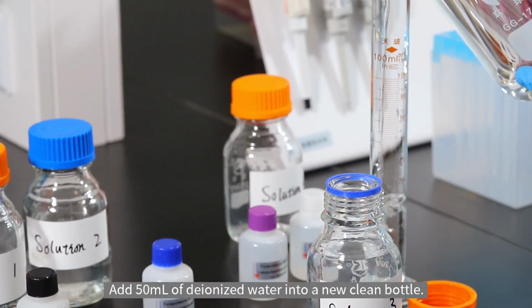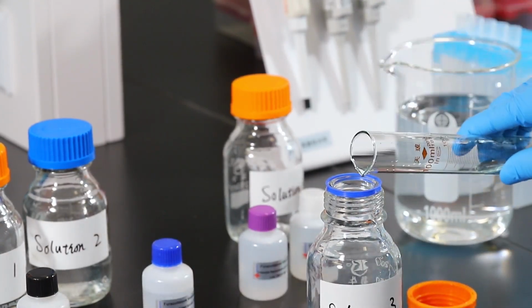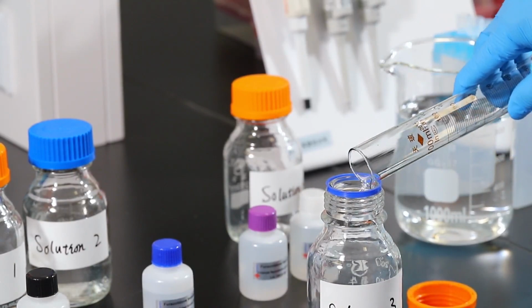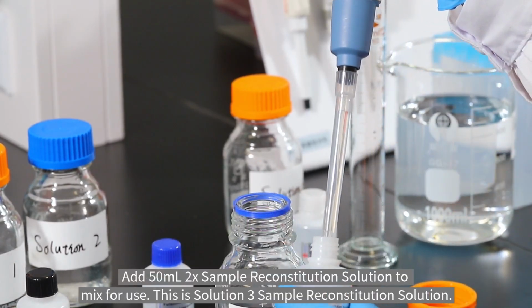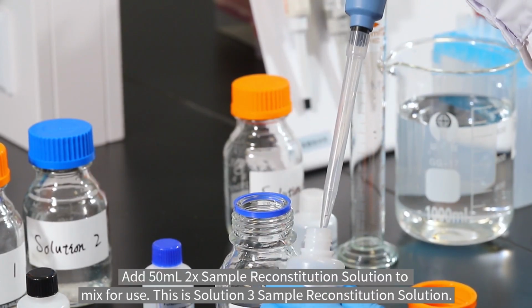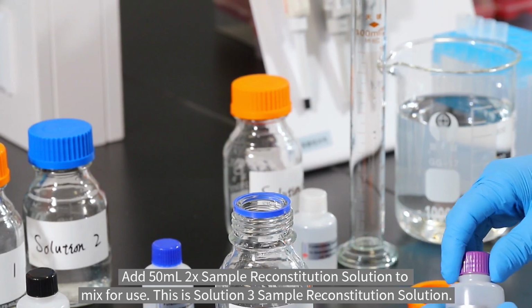Add 50 ml of deionized water into a new clean bottle. Add 50 ml 2 times sample reconstitution solution to mix for use. This is solution 3, sample reconstitution solution.